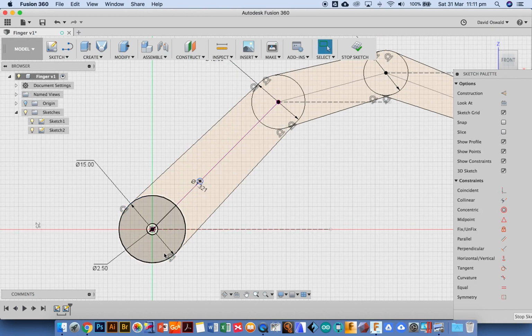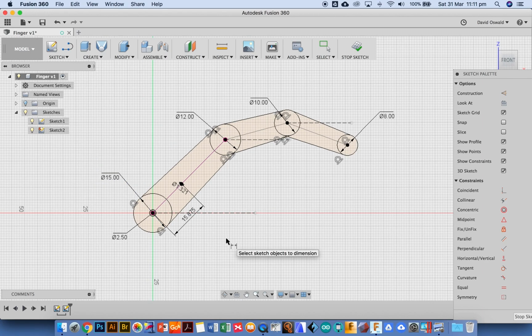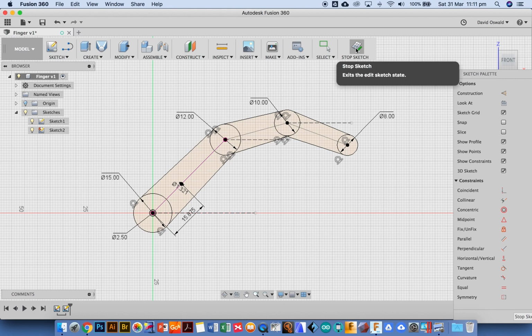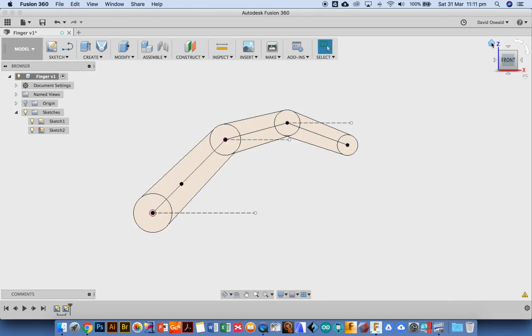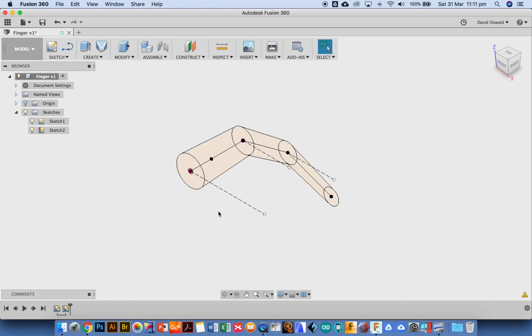I don't know where. I need to know a distance from here to here, and it's actually 15.875. So I'm going to hit D for dimension, center of circle, drag it out, click 15.875. Enter, enter. Okay, I've got everything positioned for that finger ready to go now. So I click yes, I'm happy with that. Always click on the little house, just to move everything around where you think you need it.